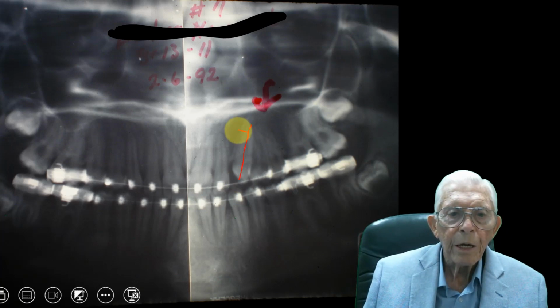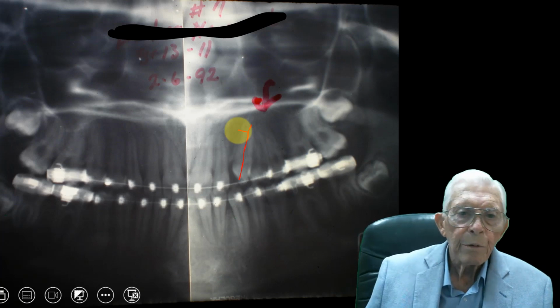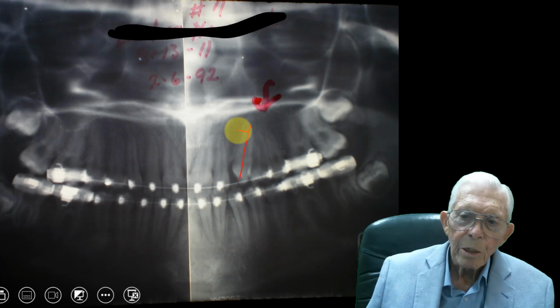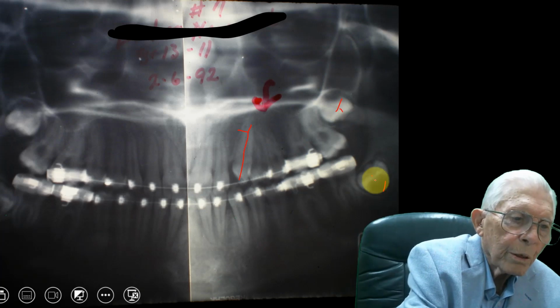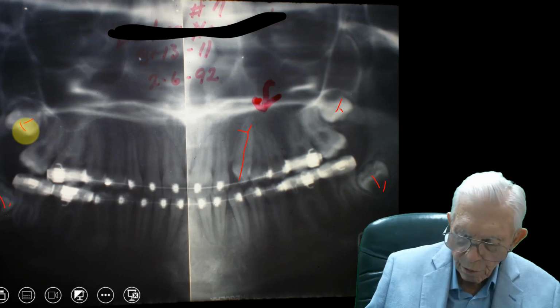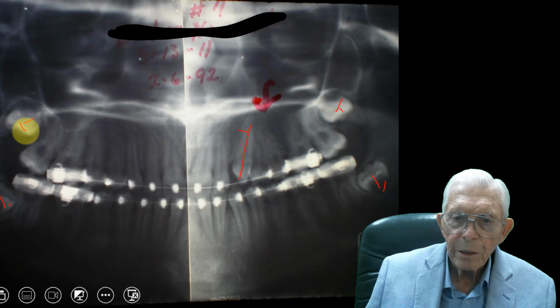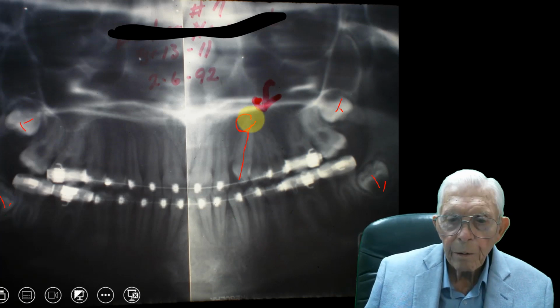And this is 92, and she's age 13 and 11 months, almost 14 years old. But they haven't taken out the wisdom teeth. And so we're going to need to get in and do something with those wisdom teeth. You don't want to leave them in there without room in the arch for them, unless you had some real bad teeth. All right, that cuspid's going to have to be rotated now. We'll have to turn it around.